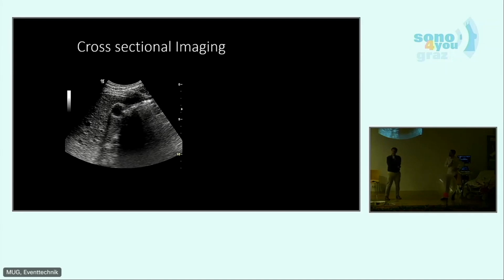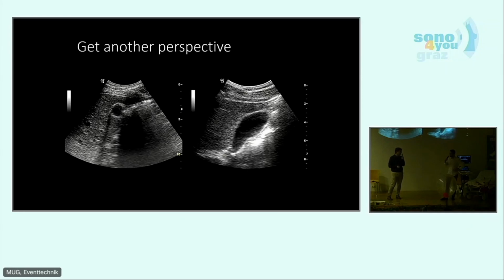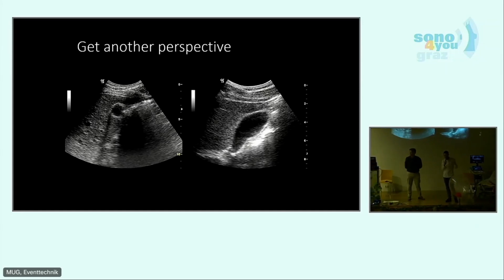How can you be sure, Romeo? You would probably take another perspective, right? Totally true. Okay, now I see. Obvious. It's the gallbladder. So what we take from this image is it's always very important if you want a precise image of the place, you need different angles. And in this case, you have the longitudinal and a cross section.